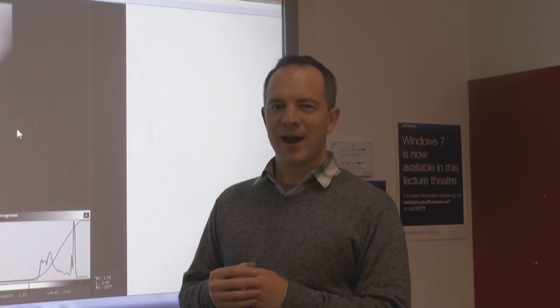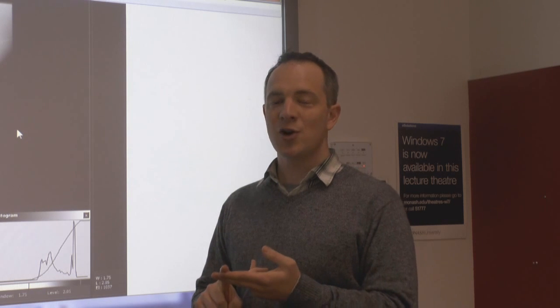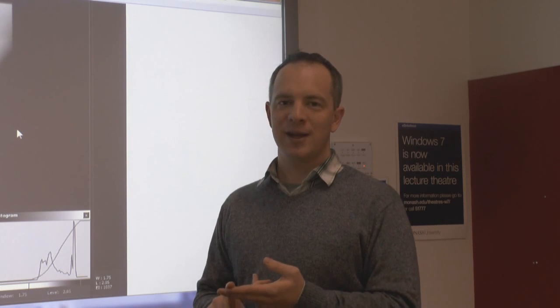So have a think about how you expect the number of X-rays and how the kVp changes is going to affect your exposure index. Keeping in mind that at lower kVps you have lower penetration power, therefore a lower number of X-rays getting through the patient, whereas at higher kVps you're getting more penetration through the patient. And also it's a non-linear relationship between kVp and exposure. So good luck with your experiment.